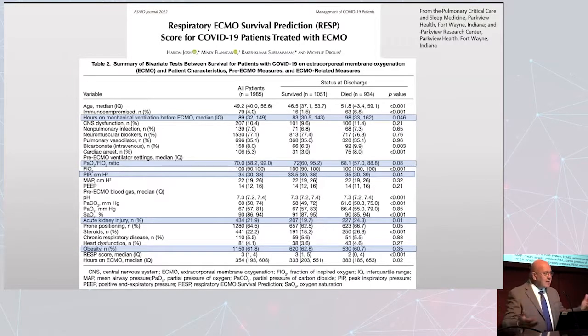So is this a patient selection issue? Is this, we waited longer and kept them on the vent and their disease is now irreversible? Is it that the previous study was that we put the patients on ECMO, maybe they really didn't need it? And I think that it's very important to understand that ECMO is in and of itself not good for us. If we take a normal, healthy person and put them on ECMO, it will hurt them.